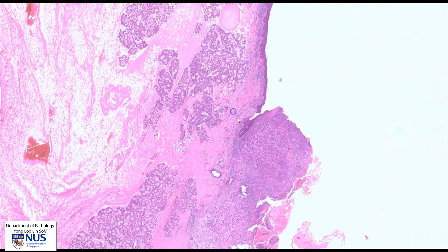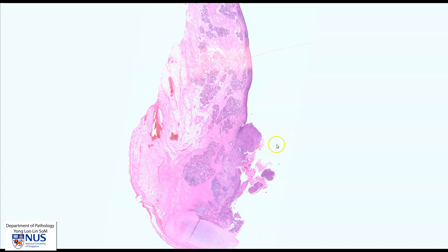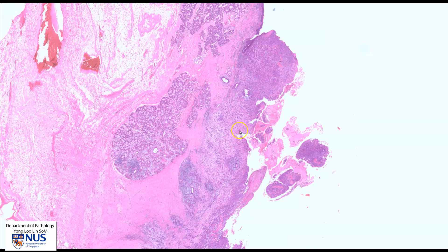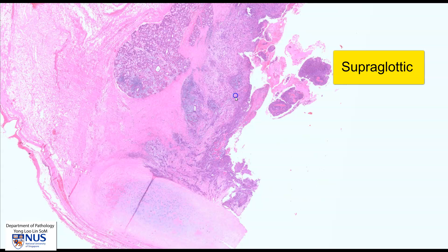So we are moving downwards, and this is the region of the vocal cords. Here would be roughly where the false vocal cord would be, and the ventricle, and then the starting of the true vocal cord. So we have this whole area that is involved by tumor, and therefore this tumor stretches from the supraglottic region and into the true vocal cord.